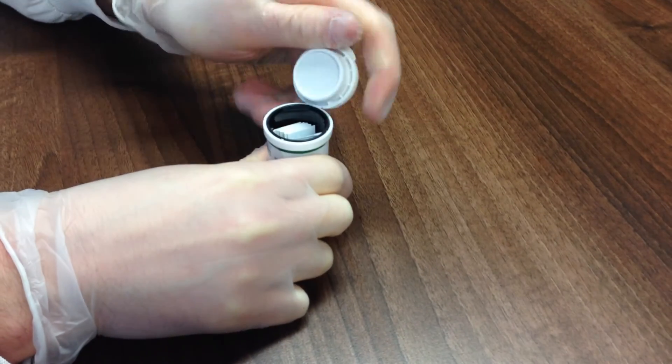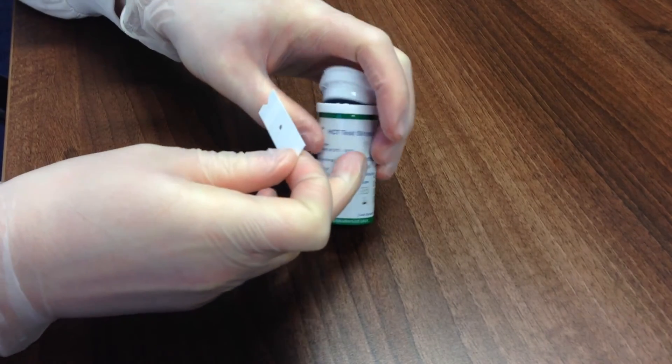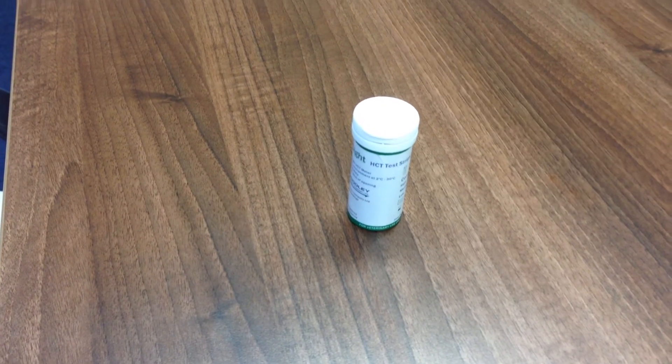Remove a test strip from its container and examine it for damage. Do not use if there are tears, wrinkles, or debris. Do not touch the test spot membrane. Re-seal remaining test strips in the original container.